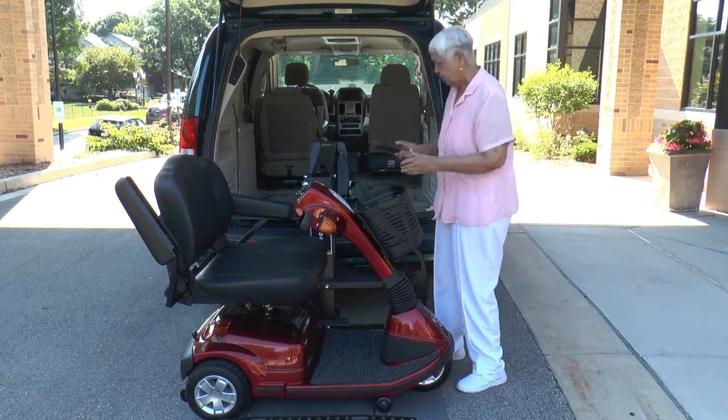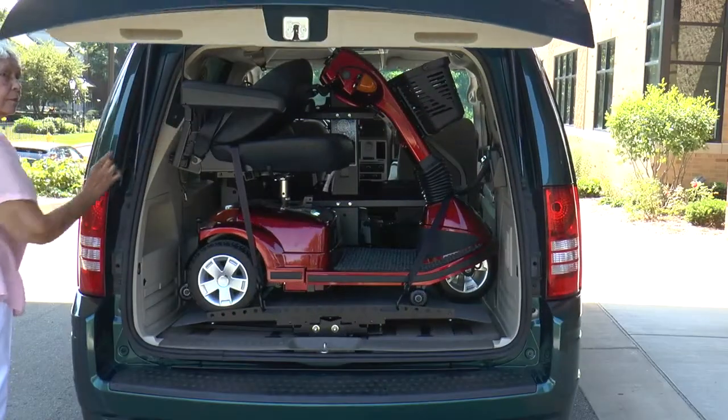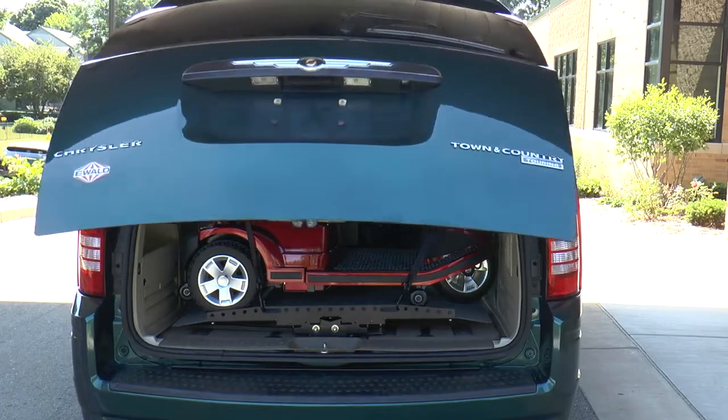Just drive up, push a button, and your mobility device is neatly stowed inside your van and away from the weather elements. Bruno's Joey is truly as easy as it gets.